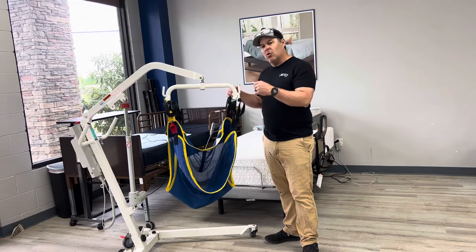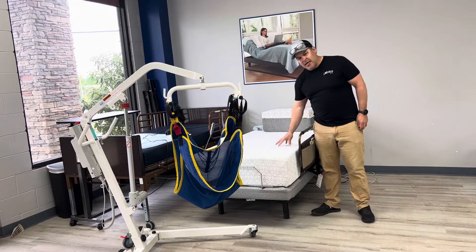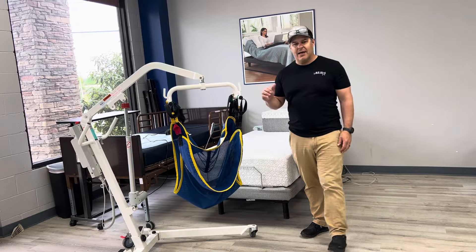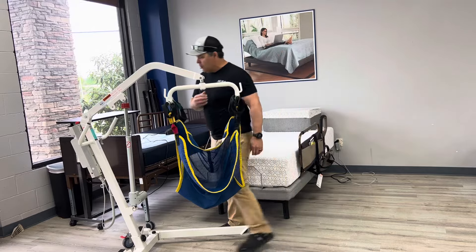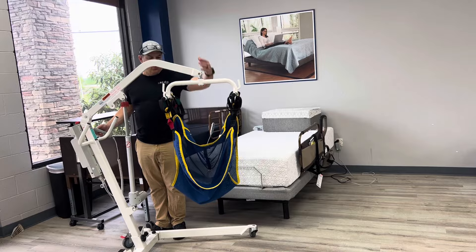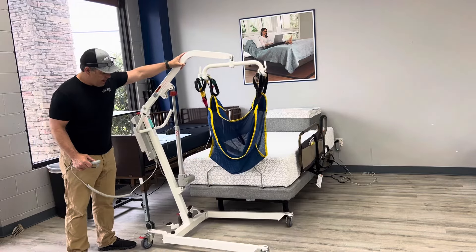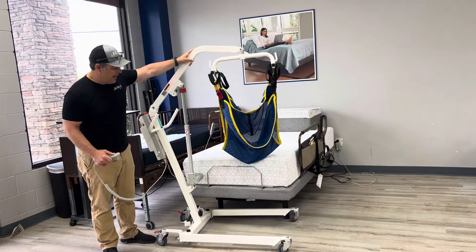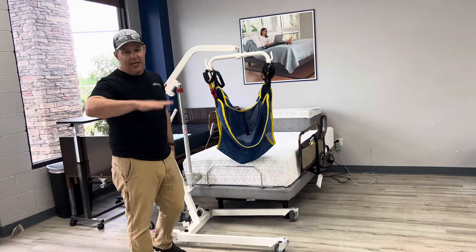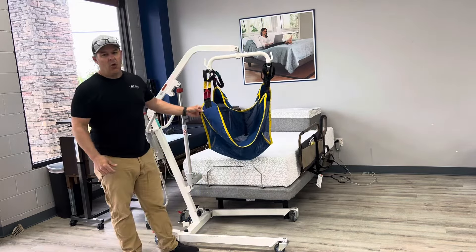Keep that in mind when you're putting the sling on. You may have to go a little higher than you want to based on the bed or chair you're dealing with. If the bed is height adjustable, you may not have to do as much — you may be able to get your patient lift high enough to easily slide the individual over on the bed. In some cases you may be dealing with a regular home bed with no height adjustability, and you'll have to adjust the slings accordingly.